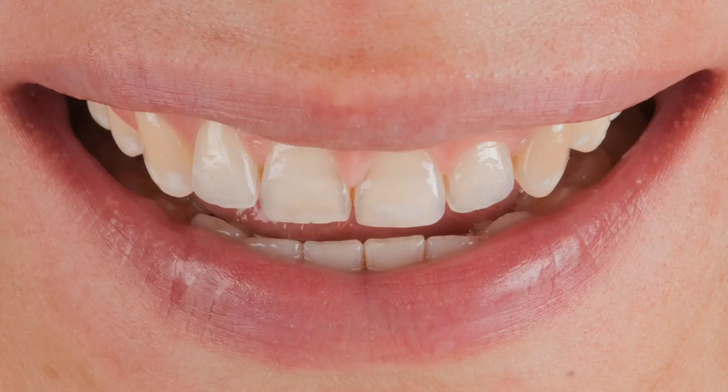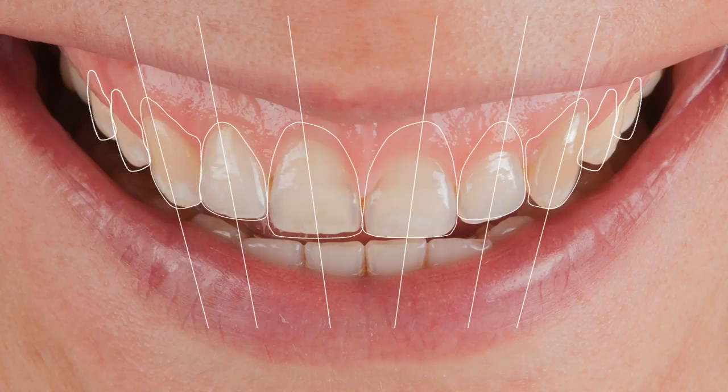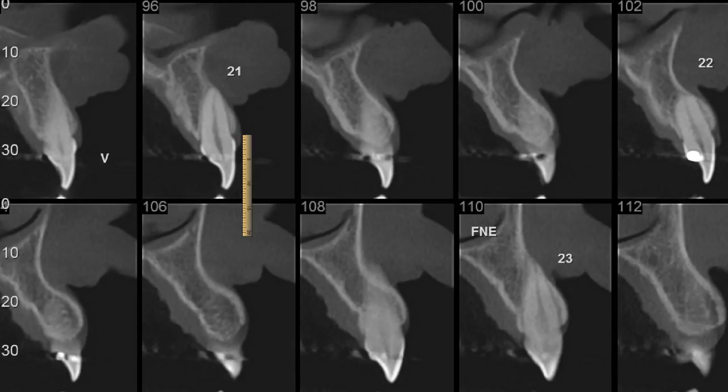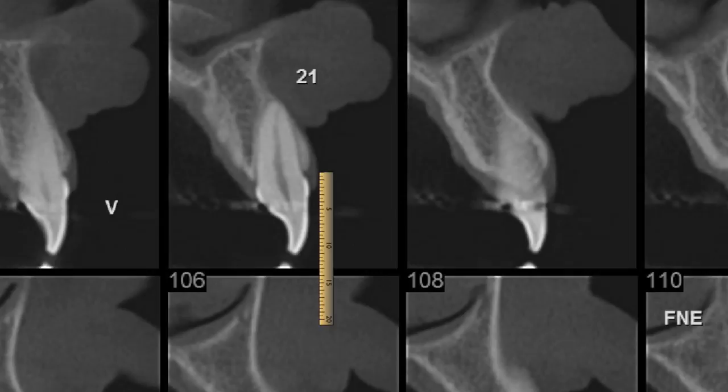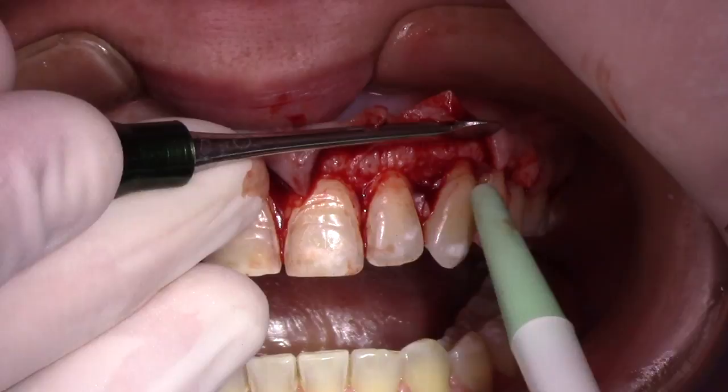For this case, to solve this very high smile line, we start with the digital planning to set a new gum contour for this patient, but always checking in these drawings the CBCT scan of the patient to know exactly where the cemento-enamel junction is and how much of the crown is actually underneath this tissue. This way you can avoid some common problems of this kind of surgery.